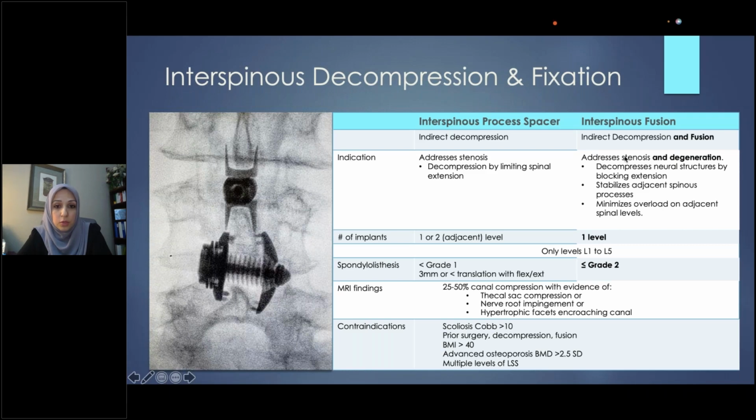So if they have an upper cervical problem and their pain's all lumbar, as far as the curve being up higher, it's not going to affect the lower spine. So it's only if the curve is at the index level. If they've, again, had prior surgeries with fusion or hardware, or their spinous process is missing, they've had a laminectomy or something like that, you're not going to be able to optimize this particular device if the surgery is done at the index level.